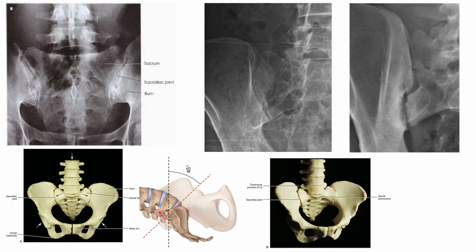And that's because of the anterior angulation of the sacrum itself, the way it sits angled in our body. So that central ray has to go into that angle at the lumbosacral junction. So it requires a 30 to 35 degree cephalad angle because of that anterior angle of the sacrum itself. The SI joints are formed here at the auricular surface of the sacrum, where it unites with the ilium of the hip. So that is why we have to create such an angle on our tube for this image.